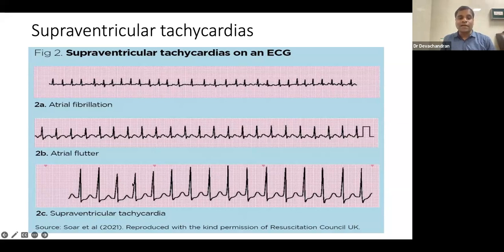In the supraventricular tachycardia, you have what is traditionally called SVT at the bottom. So really fast rate. A couple of big squares between the R's, so the heart rate is about 150 here. Here, you have what we call atrial fibrillation. I'll talk you through all of these in a minute.